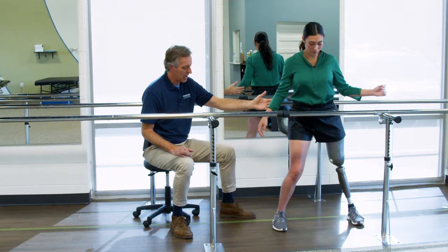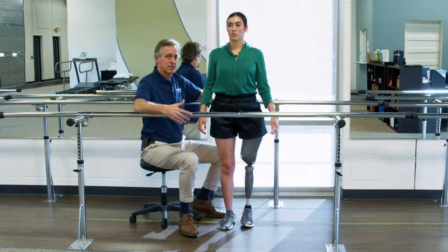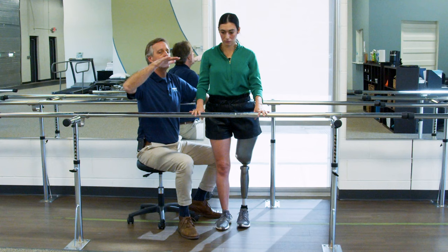Come on back towards me. Up, oh, a little bit up in the air. Up, hold, step. Good, up, hold, step. Right there. Now, as someone progresses with this, depending on what level you want to go to, you can have them say, I want you to count, hold for a two count. Up, hold for two, and then step.